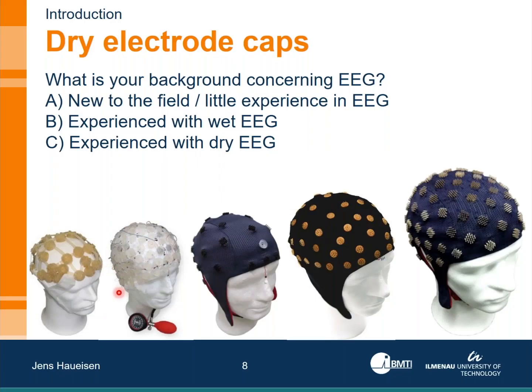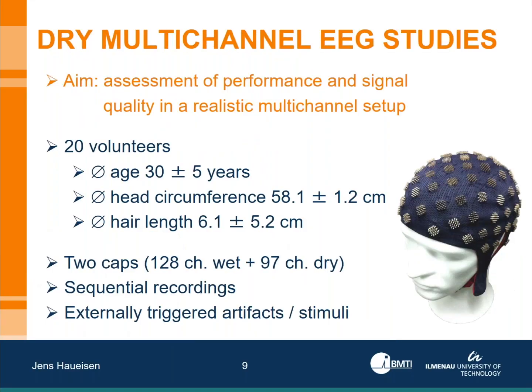Yeah, so I would like to continue, and I'd like to point out that we have here different cap materials. I will not touch the cap materials today, but they are equally important when it comes to a good holding of the electrodes. With this, I would like to turn to a few results which I collected from some studies we did in the past, and I would like to give some initial statements about the performance of these dry electrodes in comparison to wet electrodes.